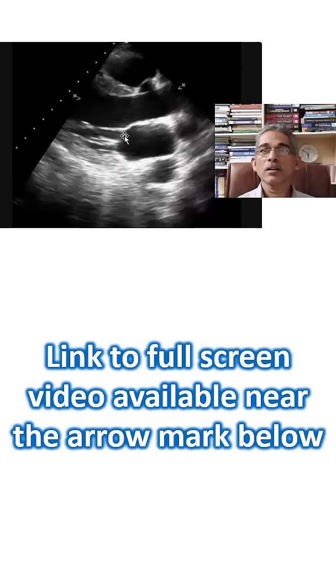Mitral valve is in the closed position. And this is the posterior wall of the left ventricle, papillary muscle, cross section of the descending aorta.